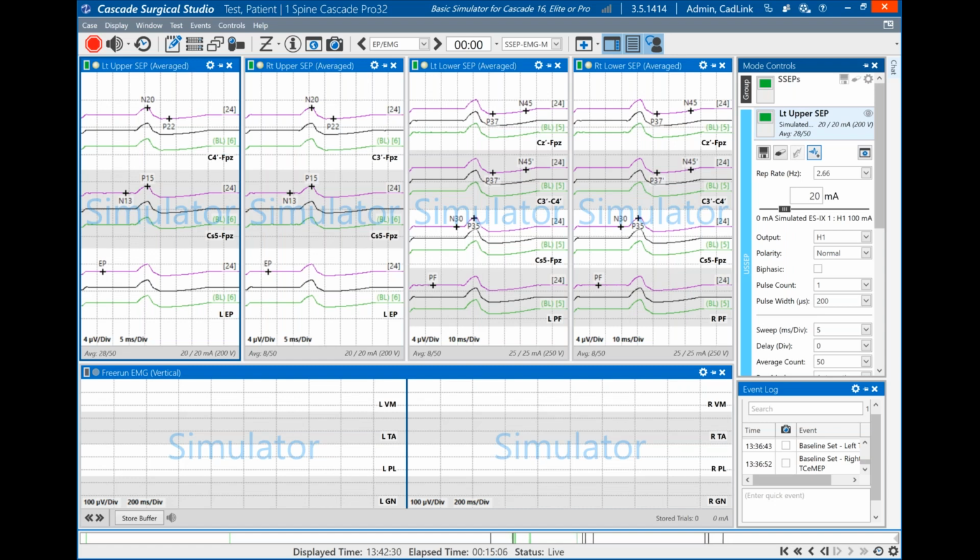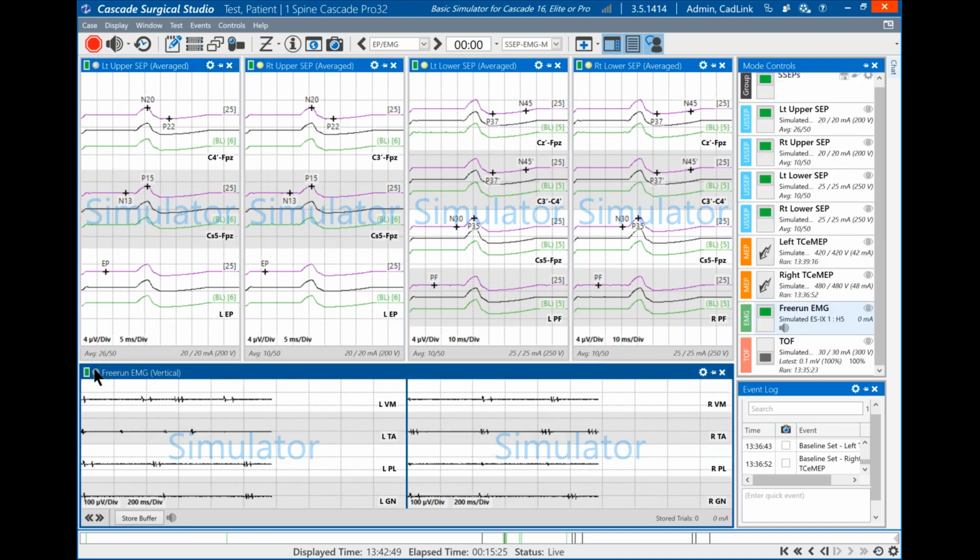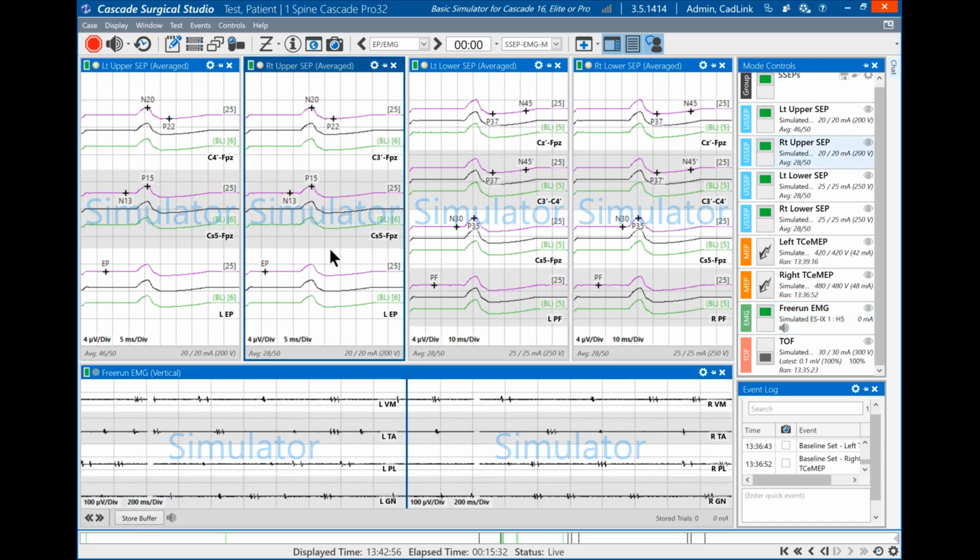Okay. A couple quick things. There is a button in each of these mode windows. You can now start and stop modes right from these buttons. I'll start my free run here. Entering events: as long as I'm not in a sub menu like a mode window or something, I can just start typing. No longer do you need to type Control Z to start and enter events.